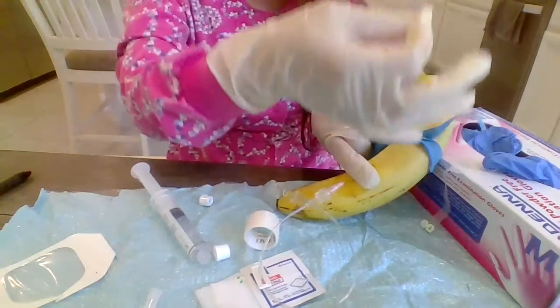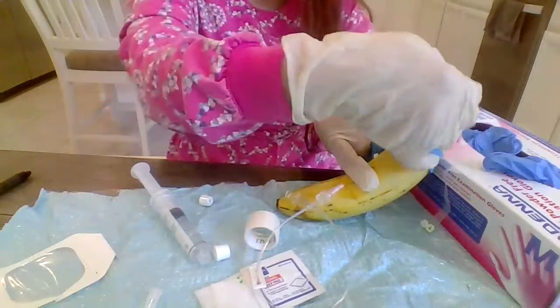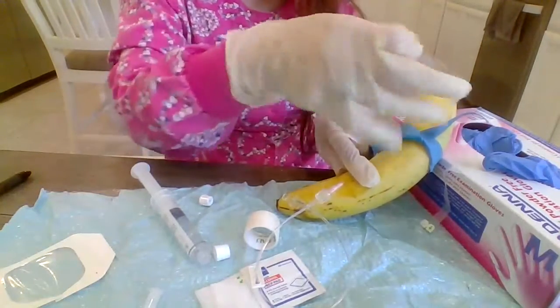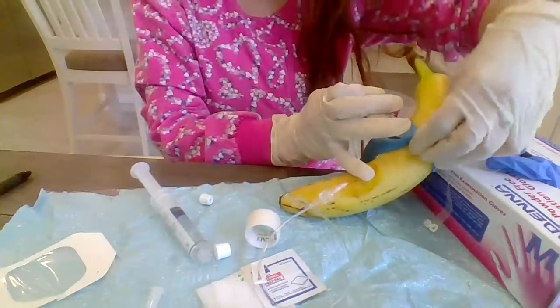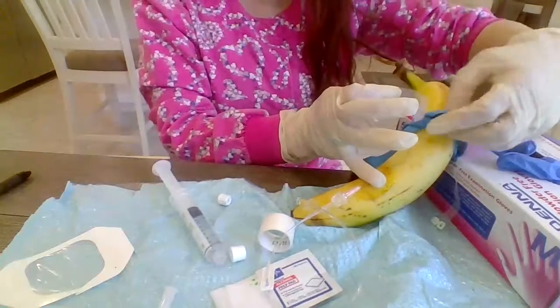I'm going to go ahead and actually release the tourniquet.